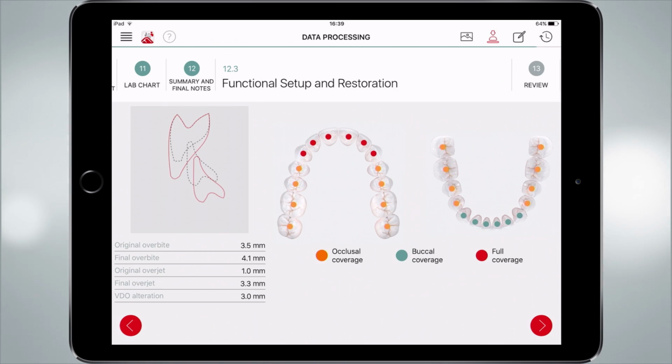Another important step is that it can be shown also to our patients. The patient can be aware of what you do. And you have to indicate to the dental technician exactly what the needs of the patient are, because the dentist is the only one seeing the patient who is capable of understanding, following this step-by-step procedure, how much you have to increase the length, the buccal position, and the vertical dimension. So all these steps are needed to be really in charge to finalize the case in a perfect way.